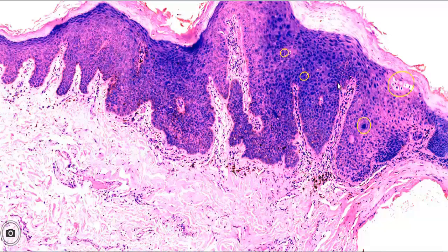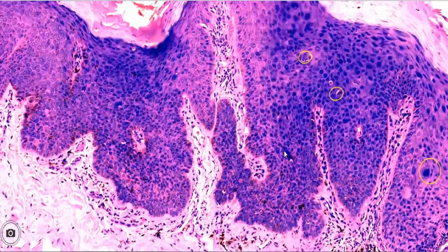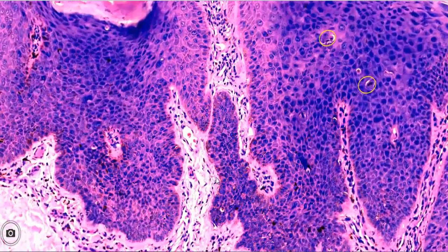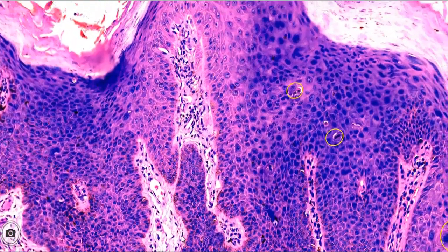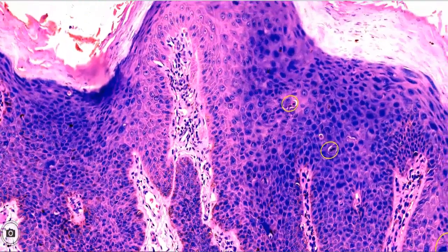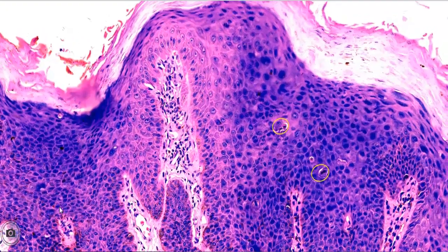Low power view shows marked crowding of cells, high nucleocytoplasmic ratio, nuclear pleomorphism, and disorderly arrangement of epithelial cells in the lower and middle layers, with relatively more orderly maturation of the upper layers. Parakeratosis can also be identified.